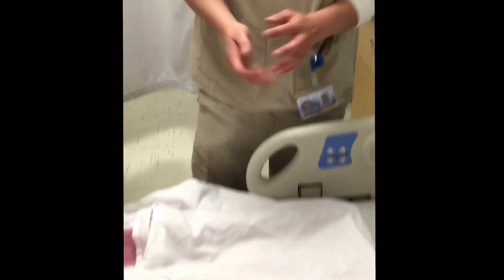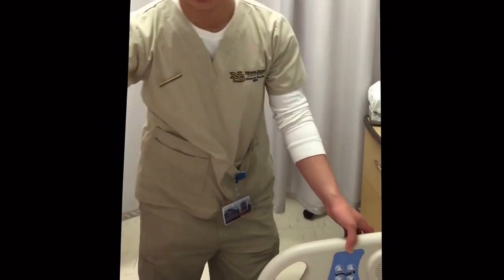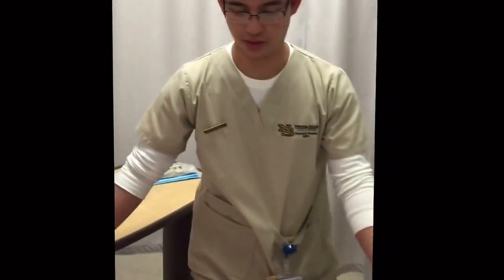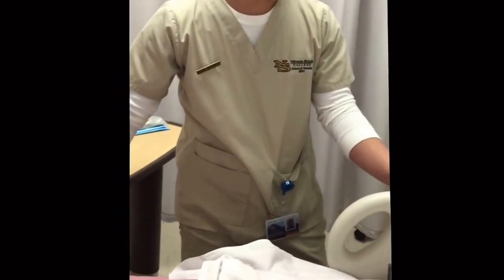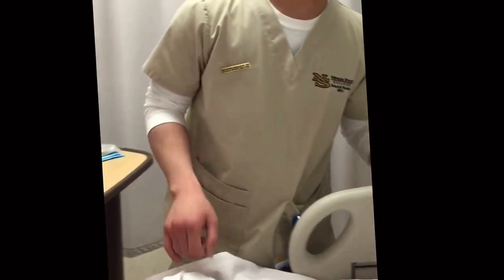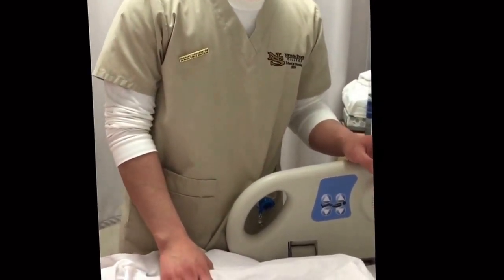That's correct. Alrighty. So let me just pull this up, okay? How are you feeling? Good so far. Okay, so the doctor ordered to take your catheter out now. So this shouldn't be as long as putting it in, okay? And please let me know if you have any pain or discomfort when I'm taking it out, okay?